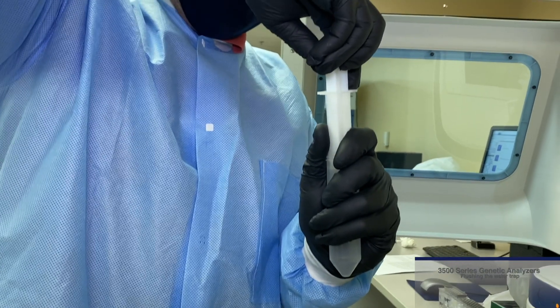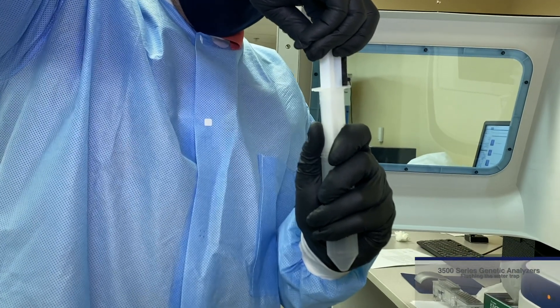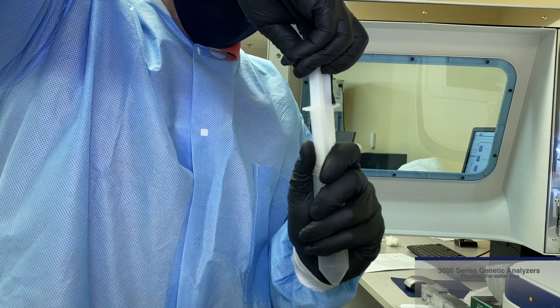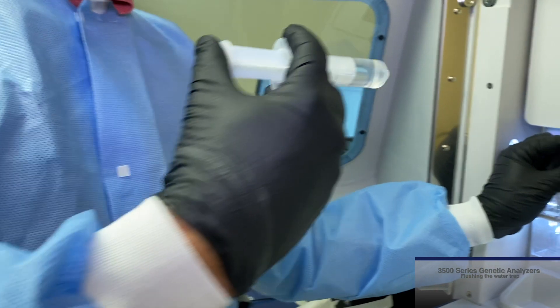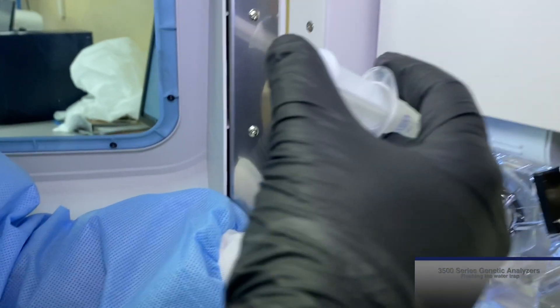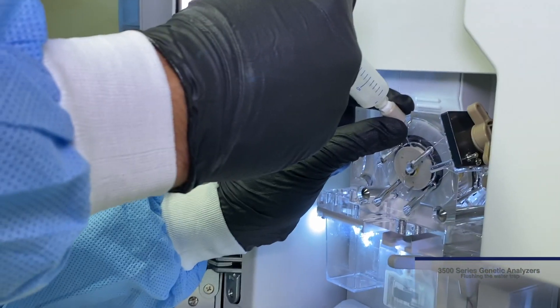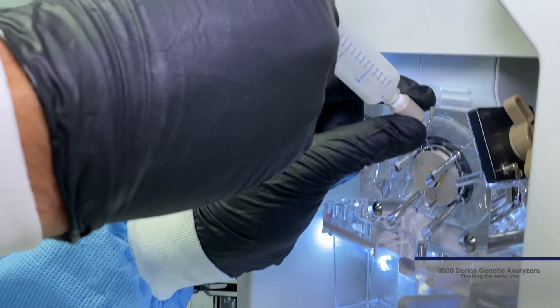Fill the syringe with distilled or deionized water and expel any bubbles from the syringe. Attach the syringe to the forward-facing lure fitting at the top of the pump block. Hold the fitting with one hand while threading the syringe on the fitting with the other hand.